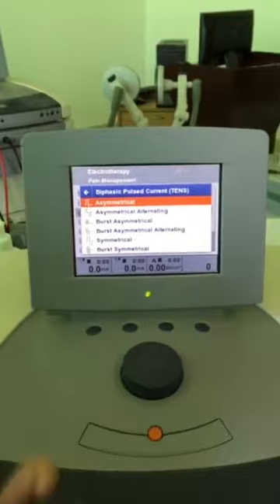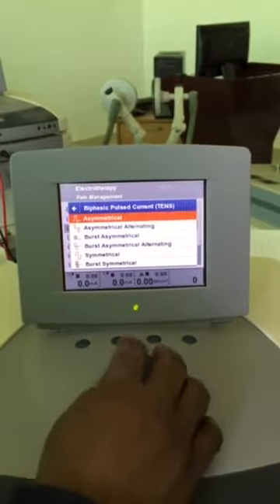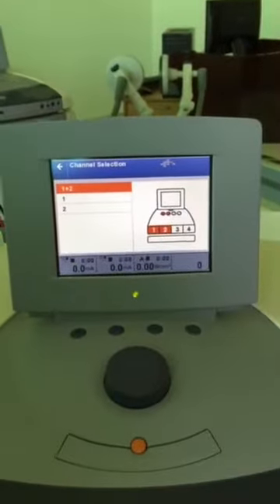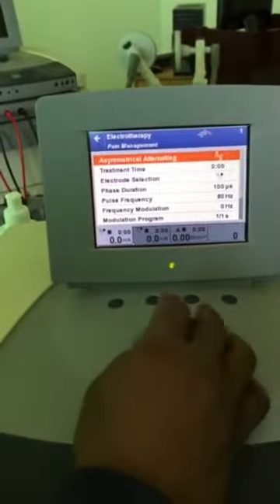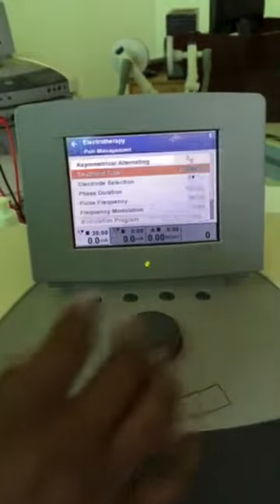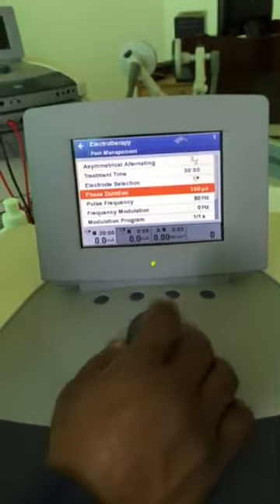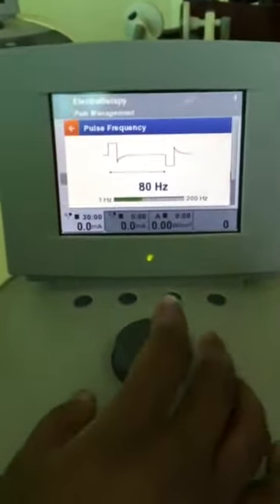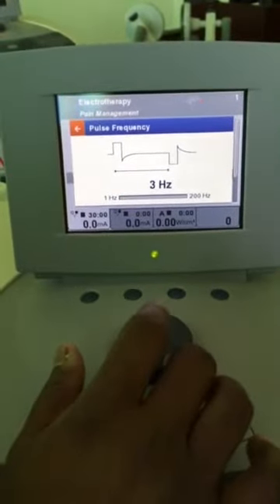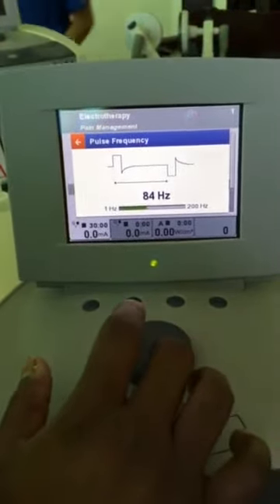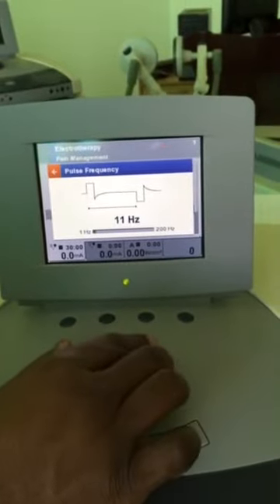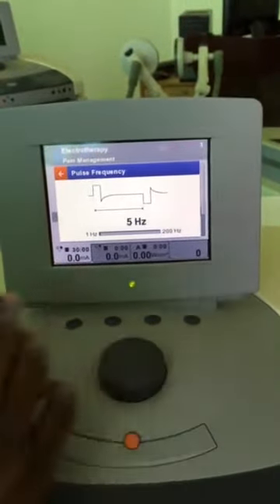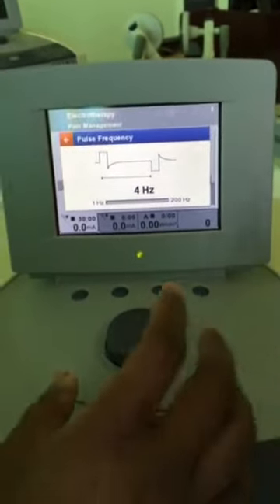Choose asymmetrical alternating. Currently I am using only channel 1, so I select channel 1. The treatment time can be kept to a maximum of 30 minutes. Electrode selection: carbon rubber electrodes. Phase duration: 100 microseconds. For frequency: if it is acute pain, select a frequency above 90, up to 130 Hz. If it is chronic pain, choose a frequency less than 10 — between 2 to 4 Hz.